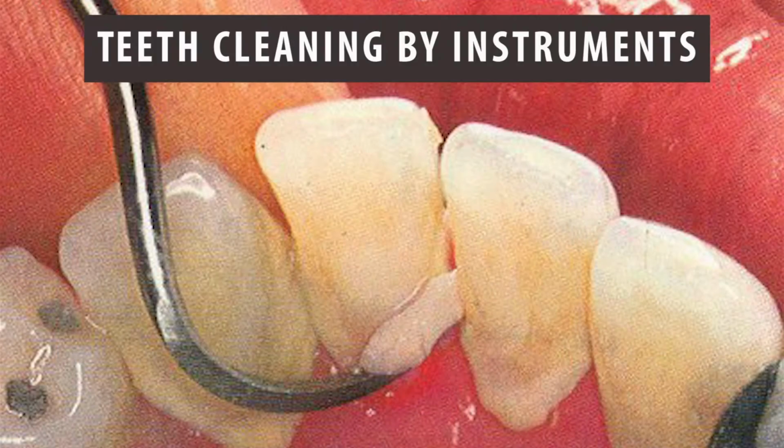Conventional periodontal therapy often starts with a deep cleaning, or scaling and root planing, which is a by-hand, by-feel procedure where, after getting the patient anesthetized, good and numb, we reach into these pockets and clean by feel. The idea is to remove all the bacteria, if we can locate it, beneath the gum tissue. After a suitable amount of time healing, usually 4 to 6 weeks after this deep cleaning, we reassess the situation, and any deep pockets that remain within the patient's mouth then go on to gum surgery.